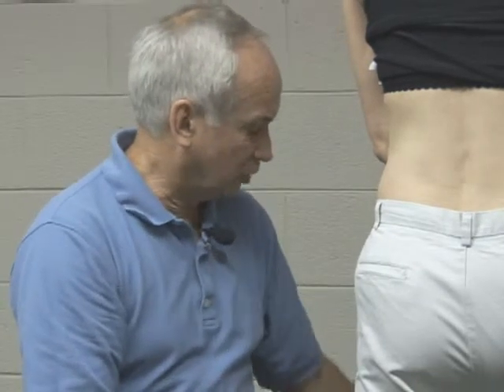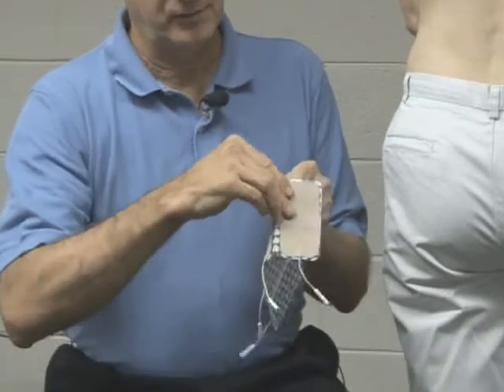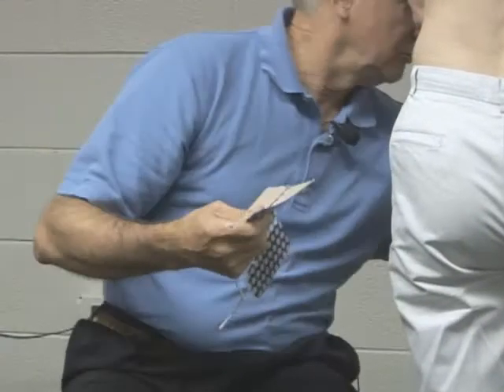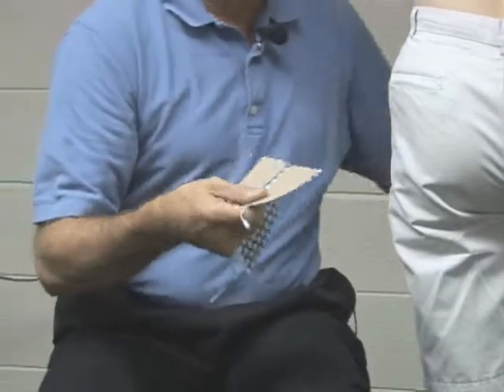What we suggest for low back pain is using a larger electrode. With this type of electrode, you can compare the size — you've got so much more stimulation area.